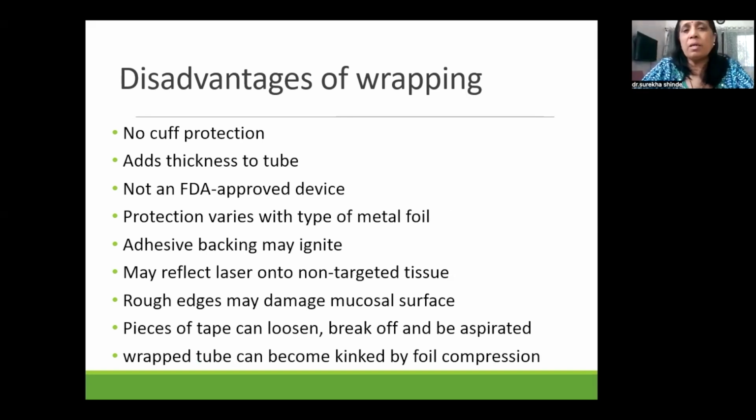This adhesive backing also can ignite if the temperature is too high. It is a reflective surface, so laser can reflect onto non-targeted tissue and unexpected tissue damage can occur. Mucosal surface also can be damaged because the tip, with its rough edges, can cause continuous abrasion, and later on you can have mucosal edema also.